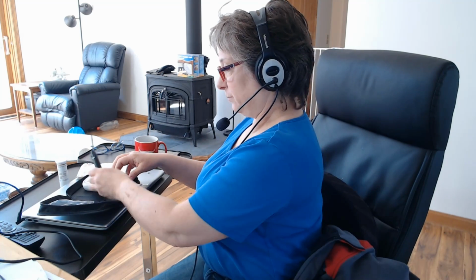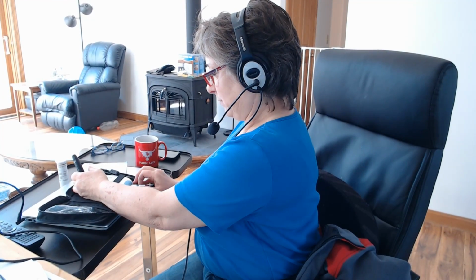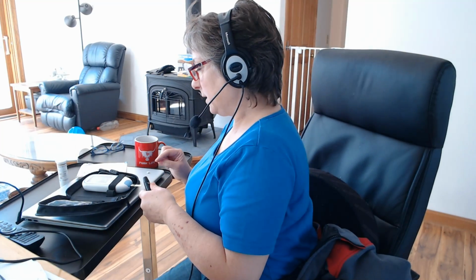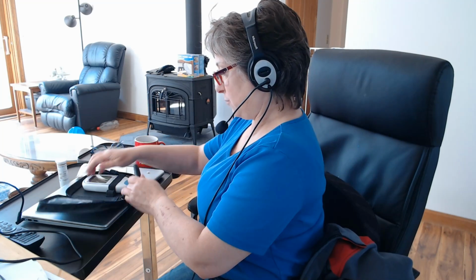Okay, so here's my little CoaguChek thing. I push this in all the way, and it's warming up. Okay, reading strip. I know there's the glare, but I press this in, and it primes the little trigger. Once this test strip is done warming up, I'm going to prick my finger and put a little ladybug of blood on it. So, test strip warming up.